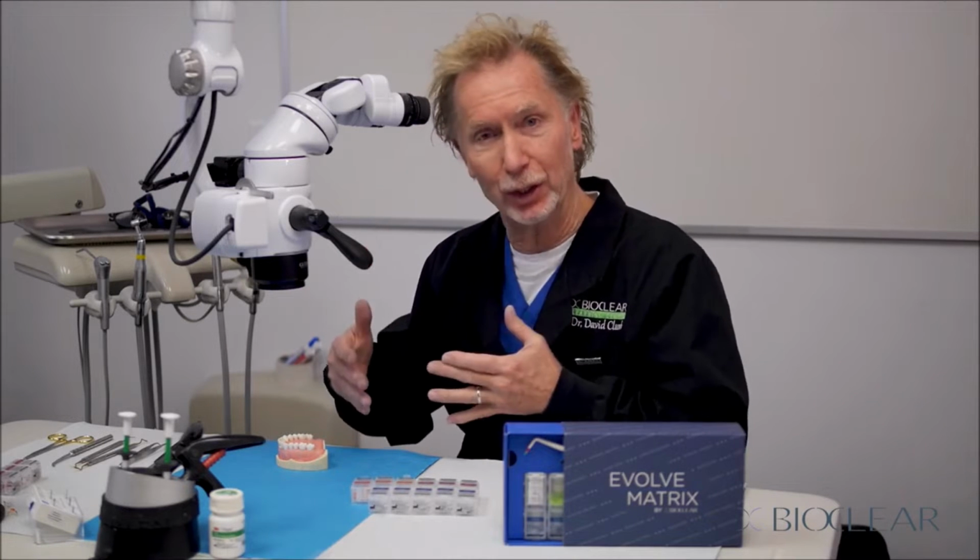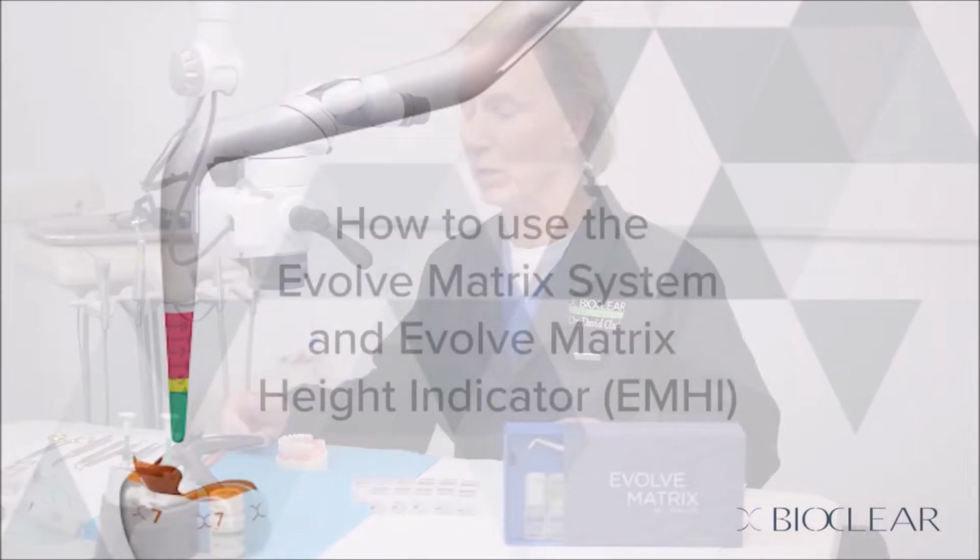Let's take a look at a couple different cavity preparations and then how we use the new matrix height indicator that will in turn help us to choose the different heights of the matrices. And then we'll take a look at the three different colors or indicators for emergence profile for the three posterior matrices.